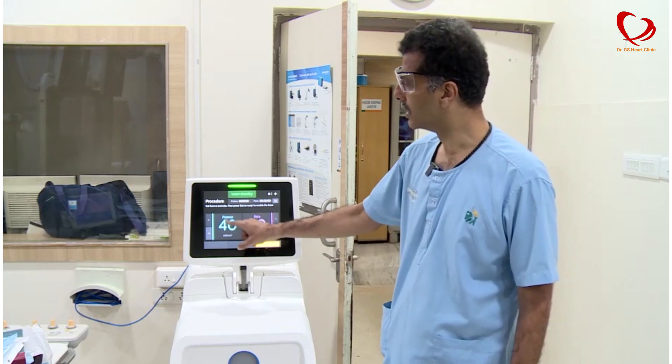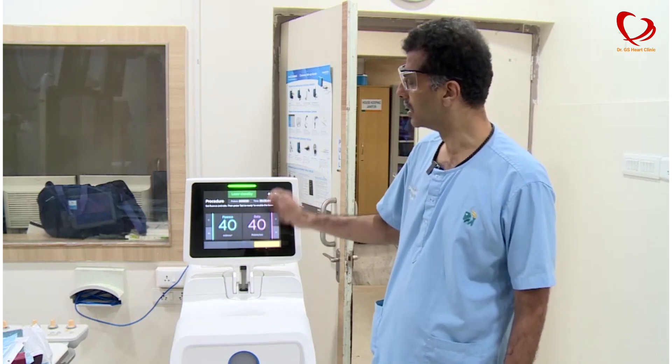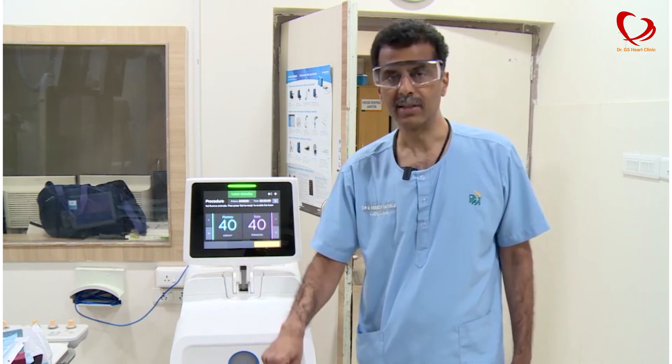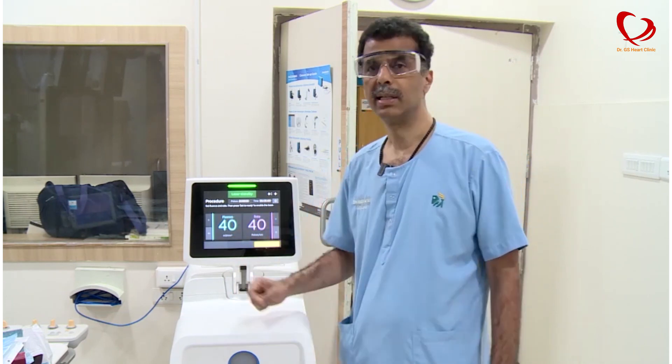This has got energy — which is the energy number — and this is the rate at which the energy is given. We control it and use the size of the catheter depending on the block and the size of the blood vessel.